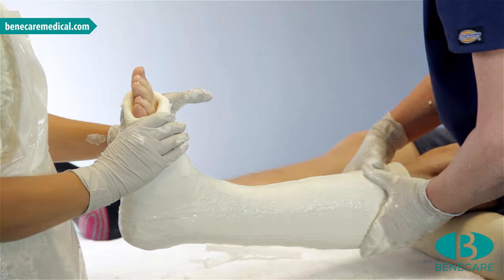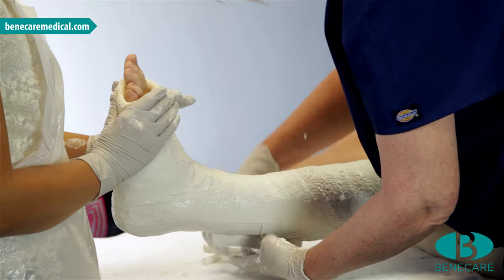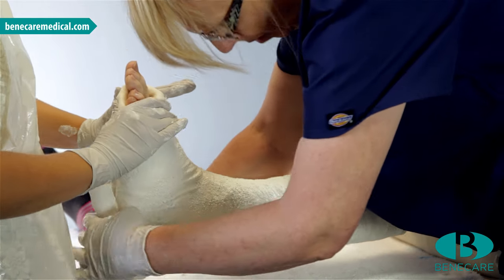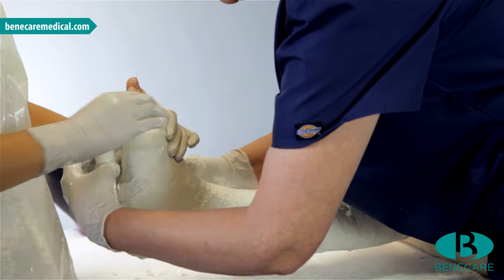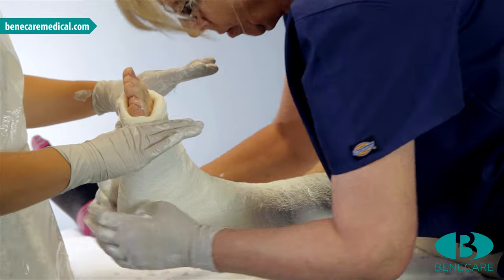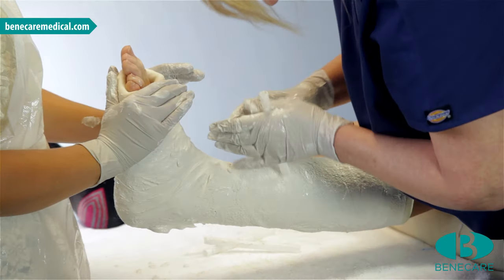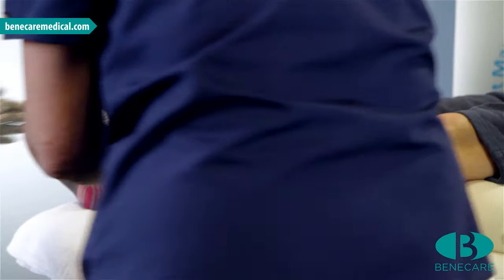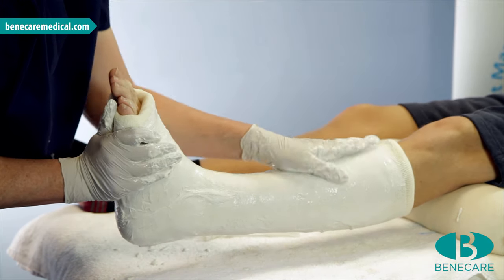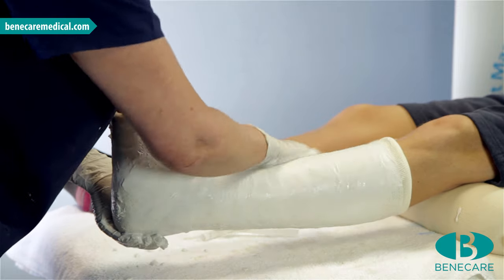Mould the cast to ensure it is smooth and has good lamination. Now continue this process with the final roll, replicating the application technique as before, ensuring you have even coverage throughout. Now change places with the person supporting the limb and mould the cast well. Using one hand to mould and one to provide support, alternating to prevent indentations.